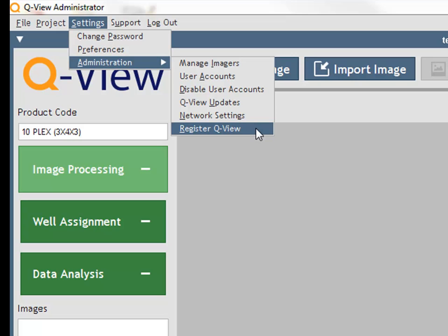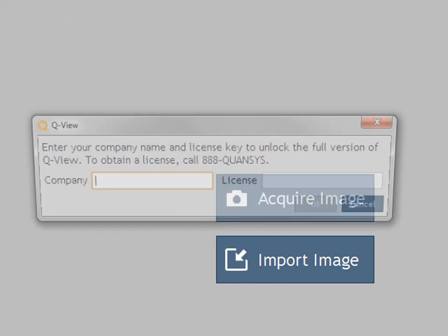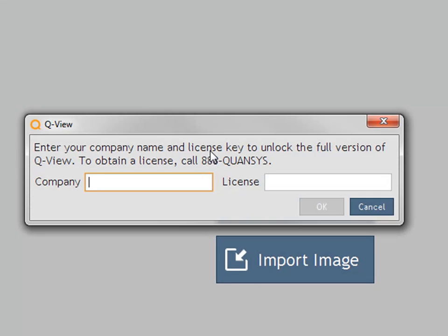Registering QView will enable you to enter your company name and assigned license code to gain access to the full functionality of QView software.